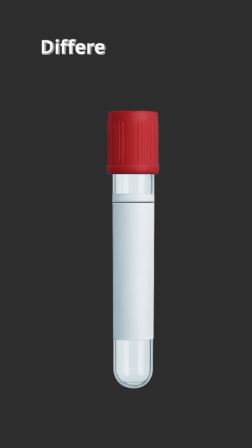Hi, today we will discuss different types of blood collecting vials and their uses.